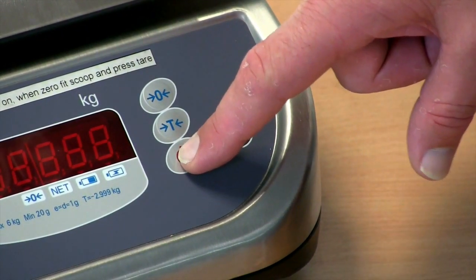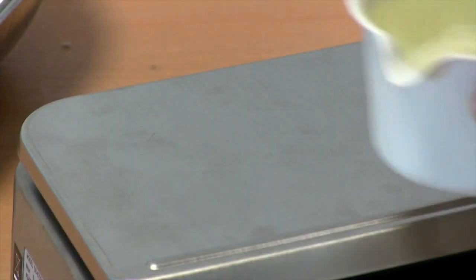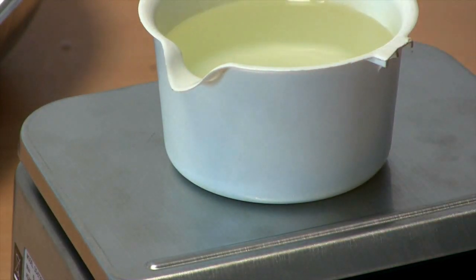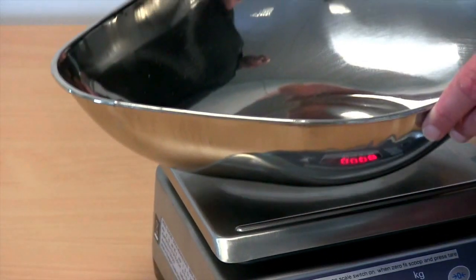Switch the scale on and when the bright display shows a line of zeros you're ready to start weighing. To weigh, simply place your item on the scale and the reading will show the weight nice and clear. The tare function allows you to remove the weight of a bowl, box or tray.